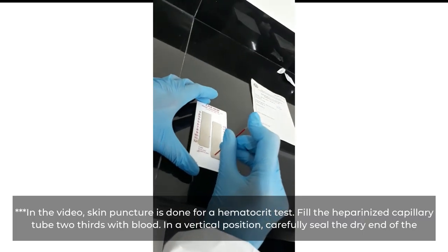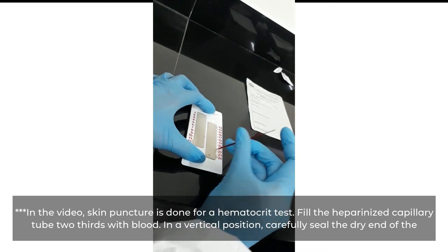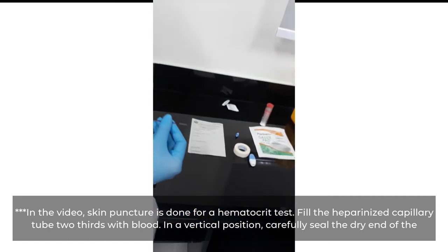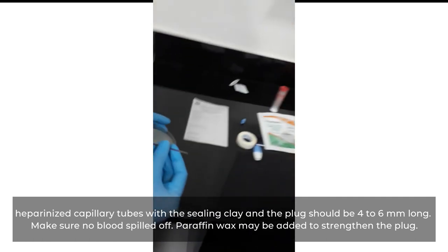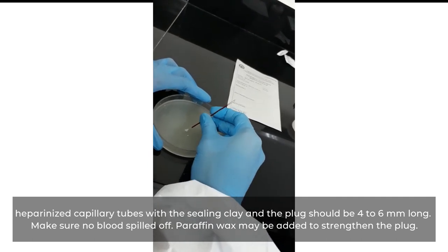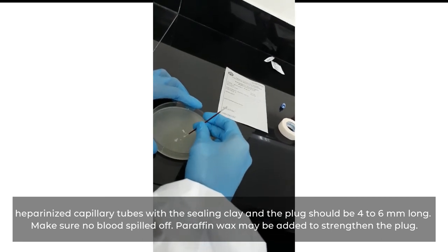In the video, skin puncture is done for a hematocrit test. Fill the heparinized capillary tube two-thirds with blood. In a vertical position, carefully seal the dry end of the heparinized capillary tubes with the sealing clay, and the plug should be four to six millimeters long. Make sure no blood is spilled. Paraffin wax may be added to strengthen the plug.